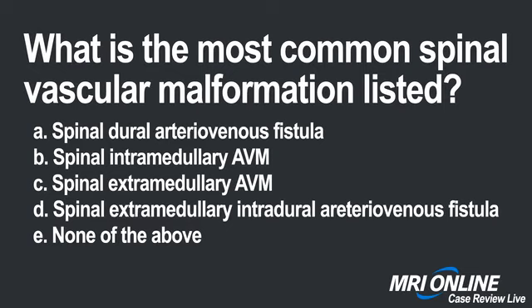What is the most common spinal vascular malformation of those listed? Is it a dural AVF, an intramedullary AVM, an extramedullary AVM, or an extramedullary but intradural arteriovenous fistula? And we'll check the answers, and the correct answer is indeed a dural AV fistula.